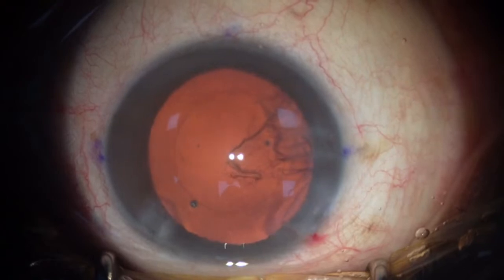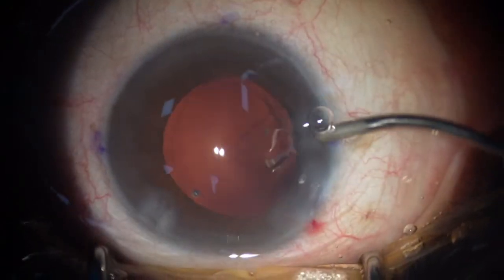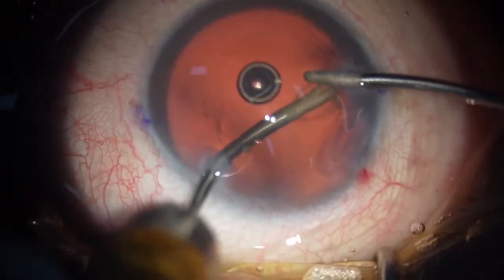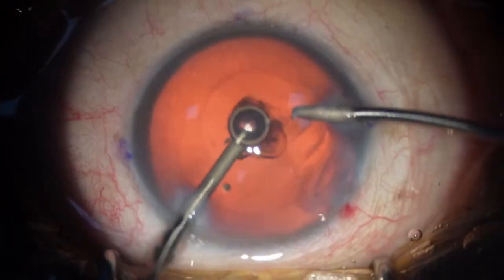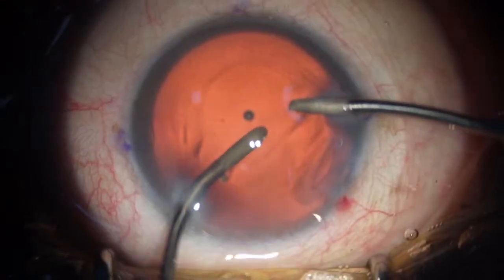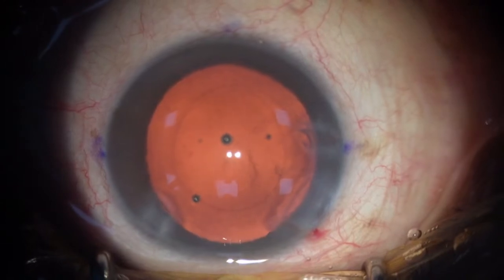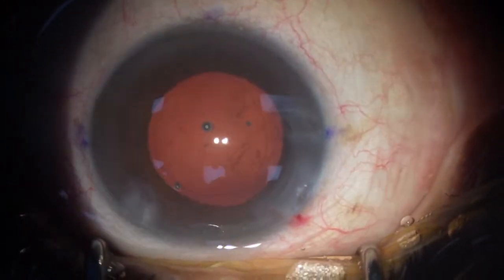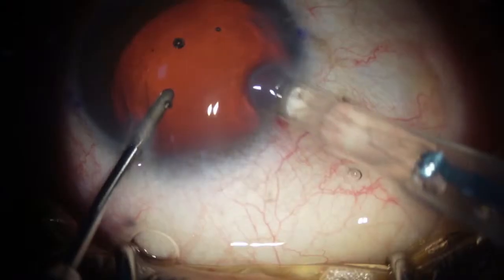So I'll be doing a hydroimplantation of the lens. Thankfully, we have a shooter available. So the iHands has replaced the monofocal mostly in my practice because it has almost no contraindications to use, even in patients with maculopathologies and other issues, even with field defects. You can use it, and patients get fairly reasonably good intermediate abilities, which allows them to do their daily work.